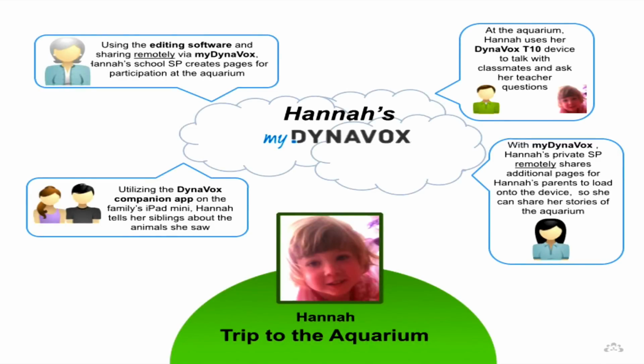So here's an example of Hannah and different ways that she's using the Compass app on different platforms with the people that work with her. In the top left-hand corner, Hannah's school speech pathologist is creating some pages for her to use on her T10 device when she goes to the aquarium this week.